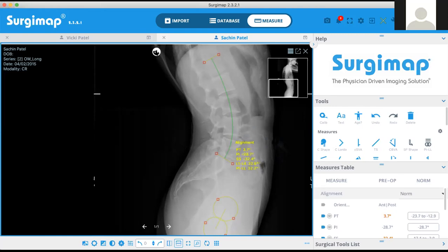Okay, got it. Other thing you see at the bottom, when I change it, the angles are changing from minus to plus and plus to minus. When I click it, so I'm making it face from right to left, all the angles below are changing, they're going into the negative value. Okay, perfect. Excellent. Thank you. So, life is simplified, Ranjit.